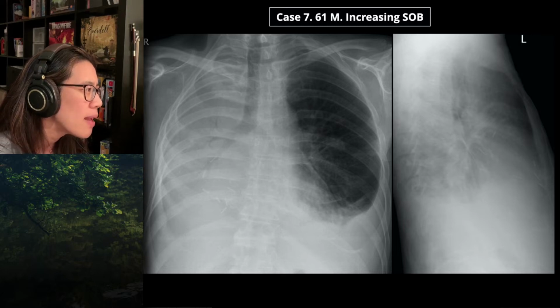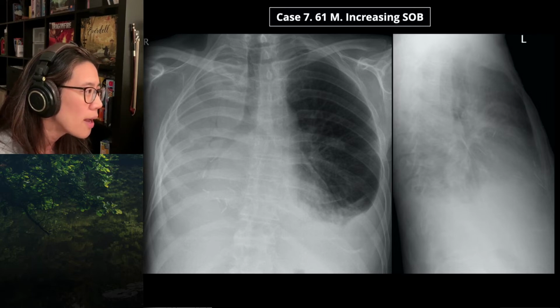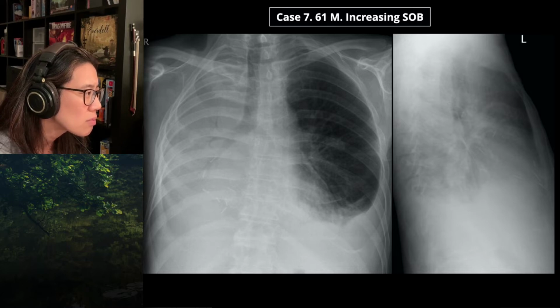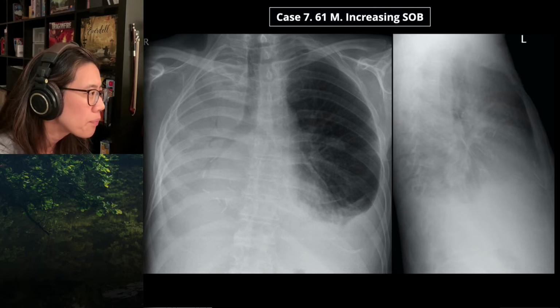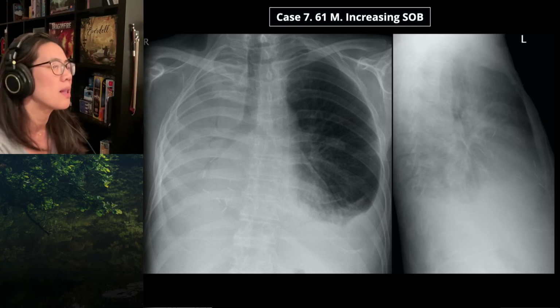Air bronchograms mean there's air within a lumen, and then around the lumen is a different density. So in this instance, it could be cells, it could be fluid, it wouldn't be bone or calcium, but basically you're seeing the lumen of the bronchus outlined with air, surrounded by structures that no longer contain air. That's actually better. It's surrounded by lung that no longer contains air is correct. That doesn't mean the alveoli are full of anything. So it could be collapsed around it.